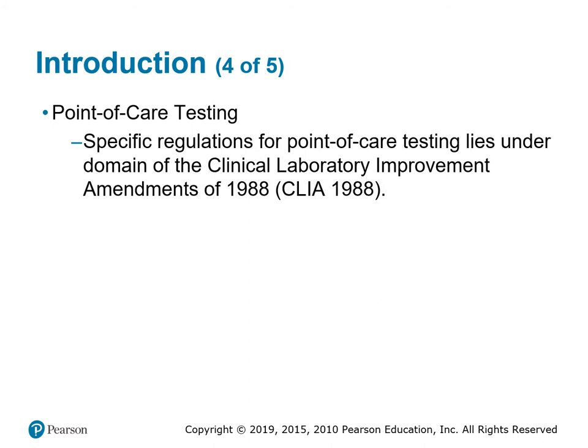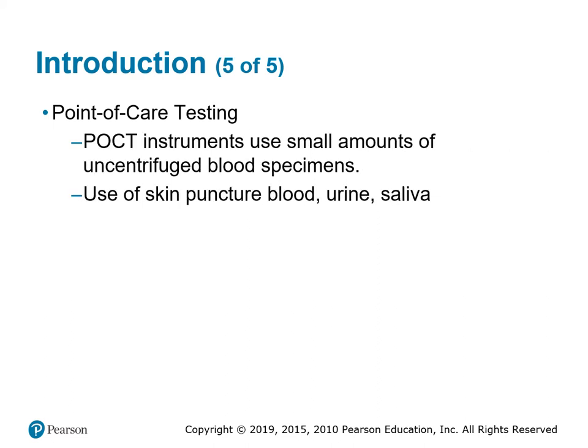Specific regulations for POC testing lie under the domain of the Clinical Laboratory Improvement Amendments of 1988. CLIA 1988. I kept thinking in my head I said 1998. POCT instruments use small amounts of uncentrifuged blood specimens. Use of skin puncture blood, urine, saliva.